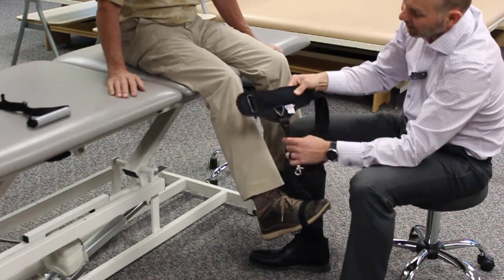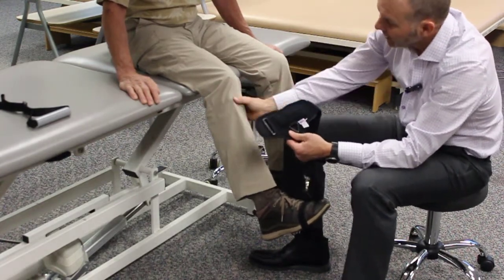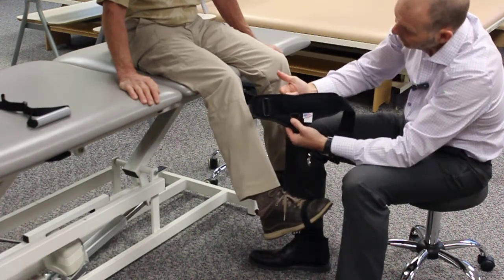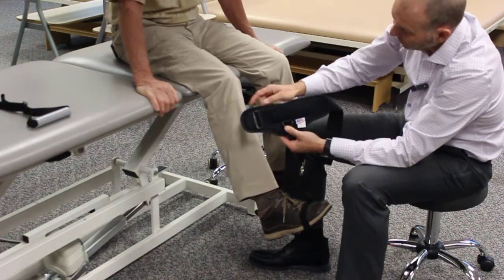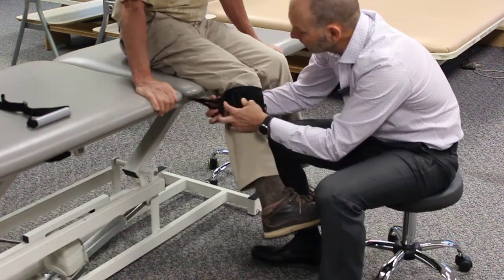So now we're going to take our piece that's got our cuff that's going to go just below the patella. There's a slight depression here in the top of the cuff that indicates where the center point is. That's going to be just below the pole of the patella. So we're going to go ahead and just place that there, wrap it around.